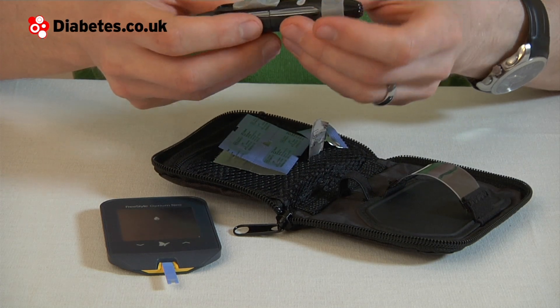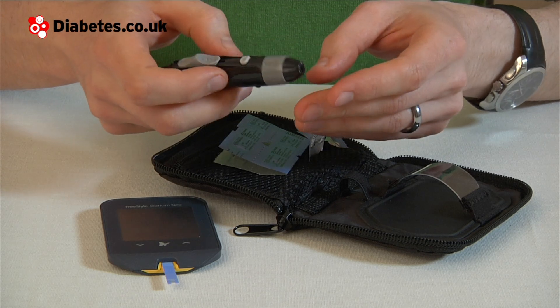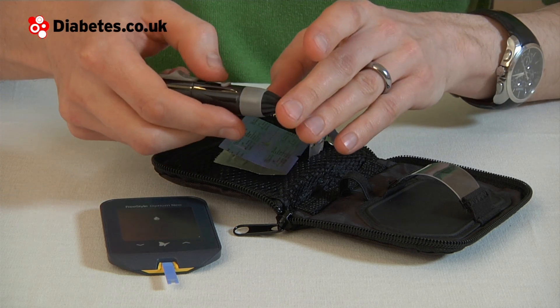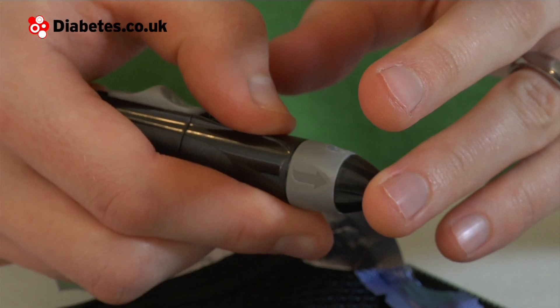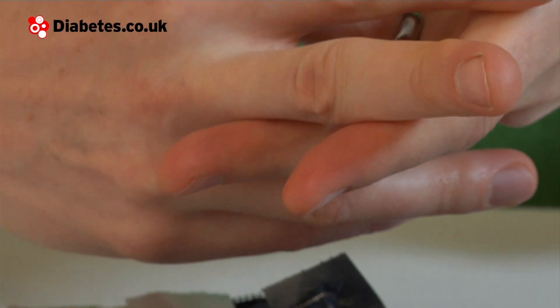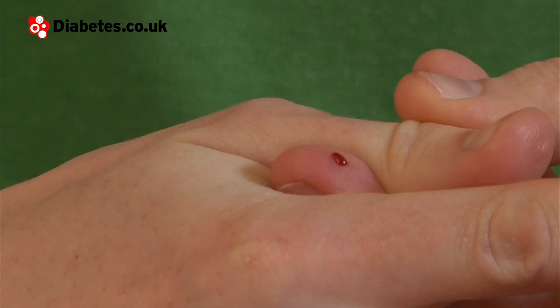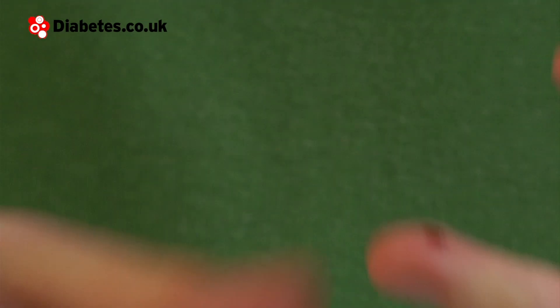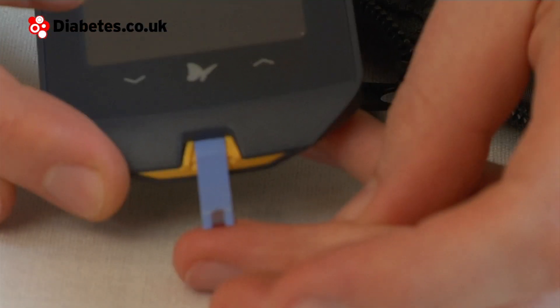Make sure your lancing device is primed and set to the depth setting you require. Put the lancing device on the side of your finger. Gently squeeze your finger to draw blood, and apply the blood to the end of the test strip, which will suck it up.